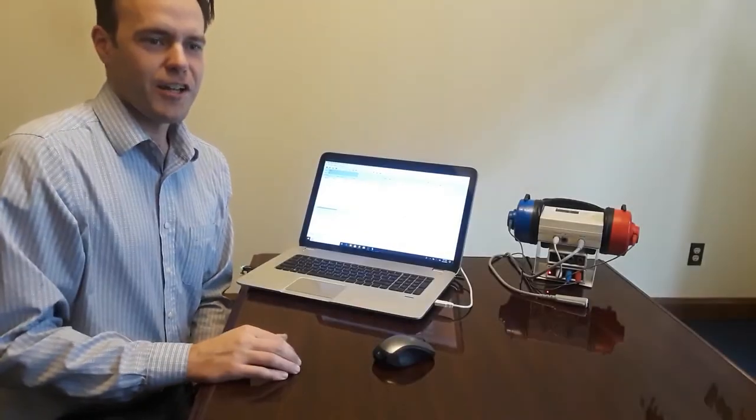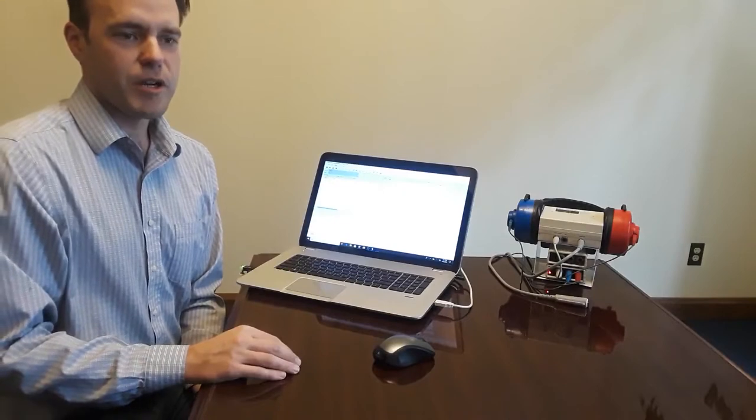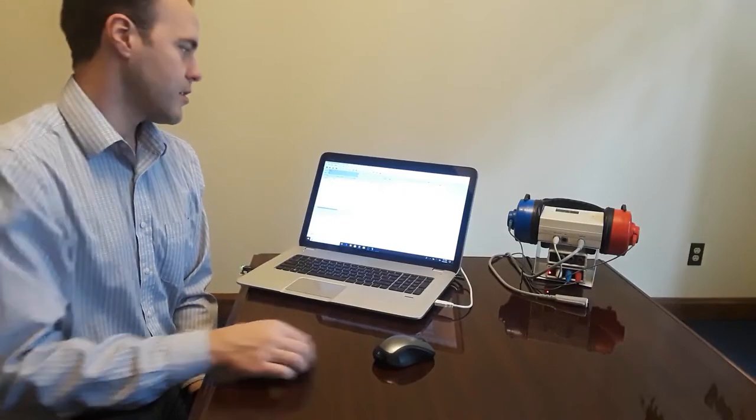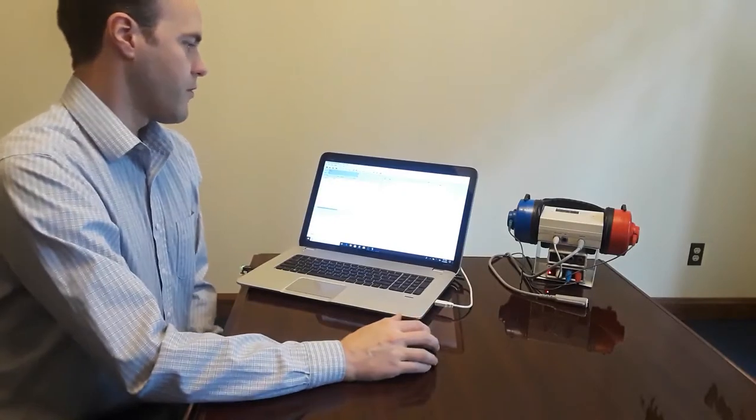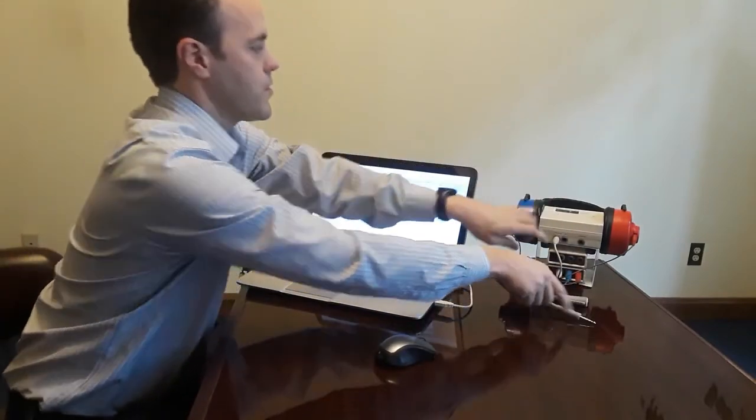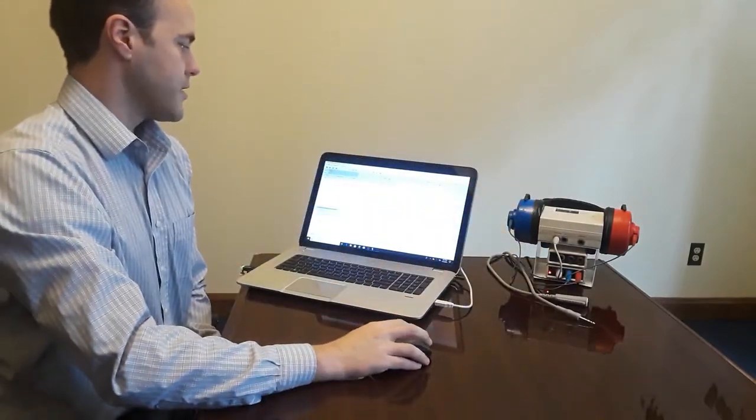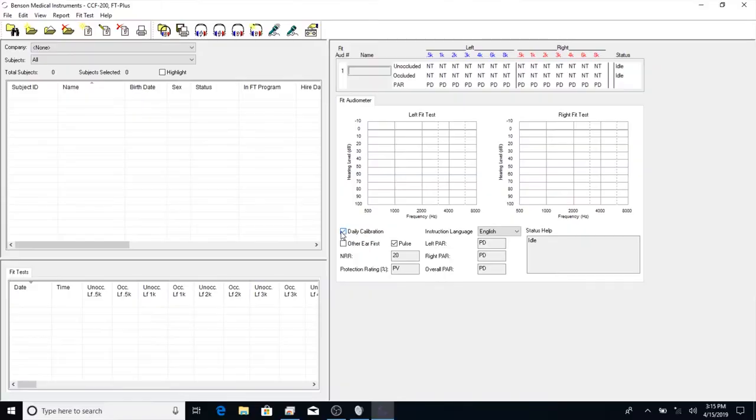Before we get started, we need to ensure the device is working properly with the daily calibration using the BAS 200 Bioacoustic Simulator. First, you'll unplug the patient response switch, which will turn on the unit. Next, click the daily calibration checkbox and press start.